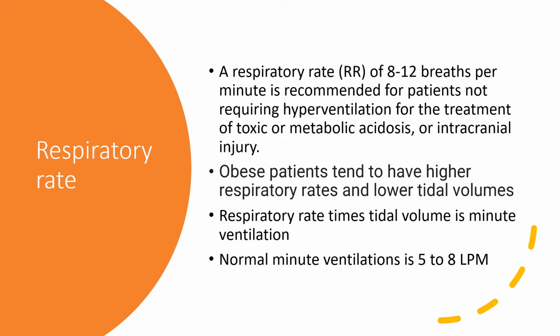Let's talk about the obese patient. A lot of times, obese patients tend to have a higher respiratory rate setting because they have a lower tidal volume. So your question is, why do they have a lower tidal volume breath compared to a normal patient?